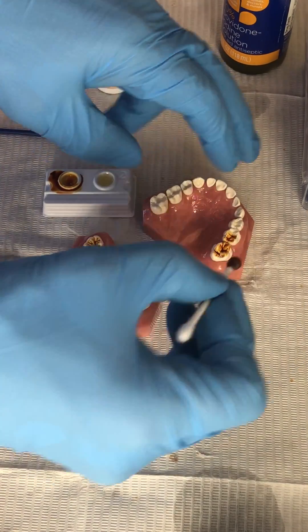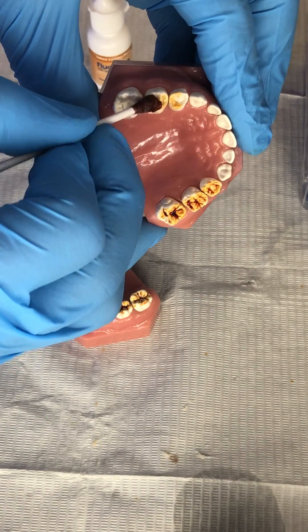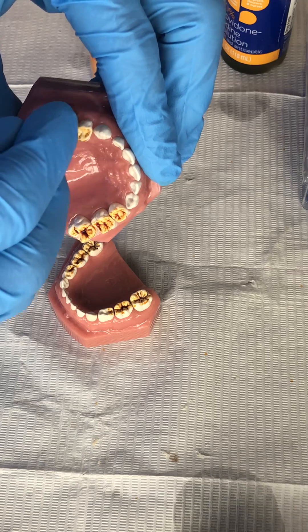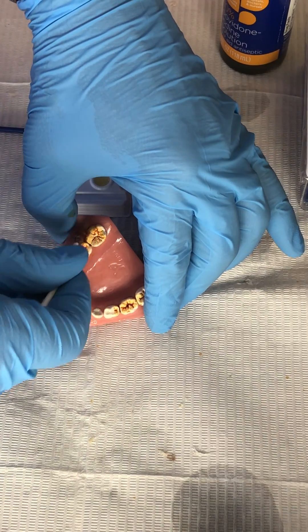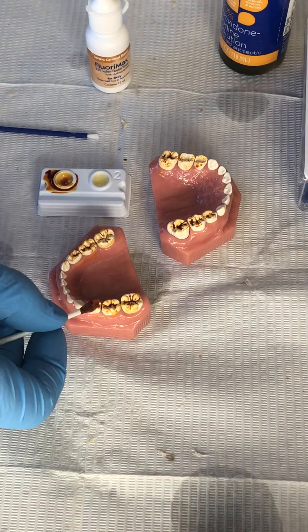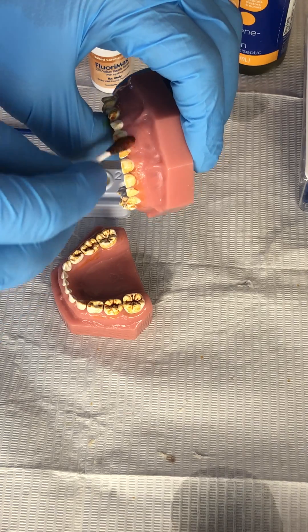You can see it — does that stain long term? No way. So this is what I like to do. You can roll it all around, whatever you like. Can you put it on the anterior? Sure. Will this cause long-term stain? No.